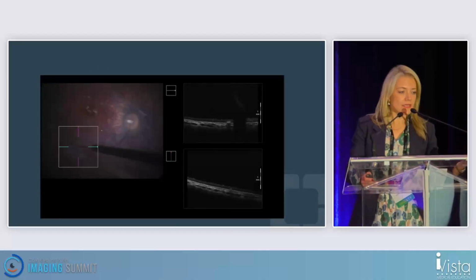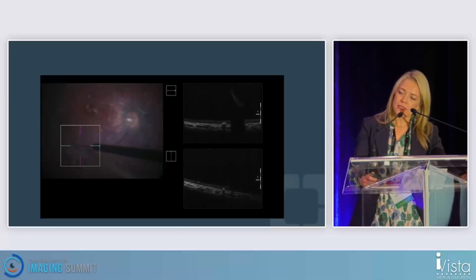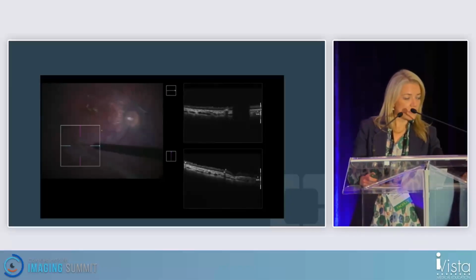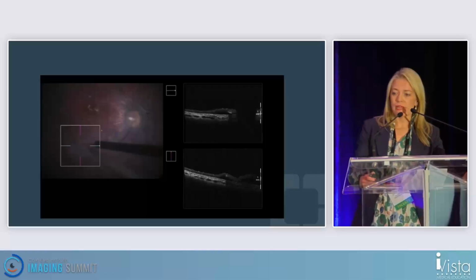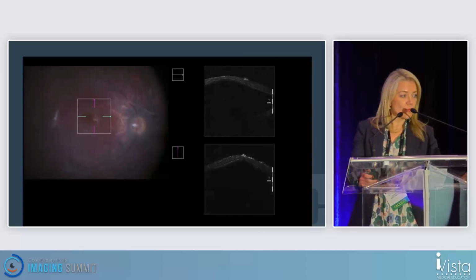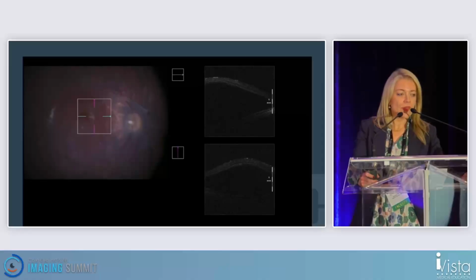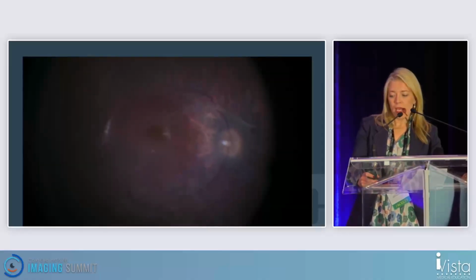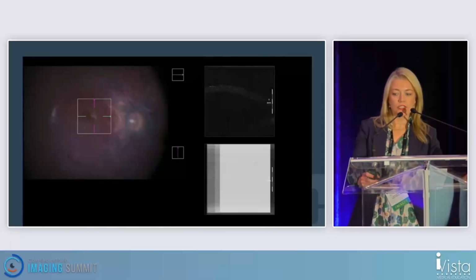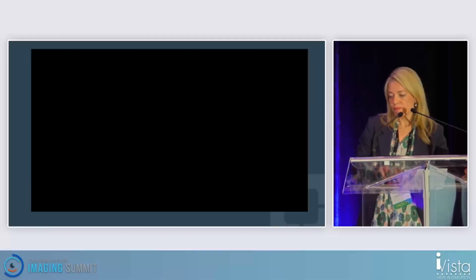And it's cases like this, if you're involved in gene therapy, for instance. This is a case of X-linked RP, and we have to deliver subretinal gene therapy in the macula. So you really want to make sure that you're in the right space as you initiate this bleb, and that as the bleb propagates, you have a nice inversion of the foveal contour without creation of a macular hole. And there's a lot of interest also in trying to measure these blebs, so we can ensure that the correct dosage was administered to this patient.